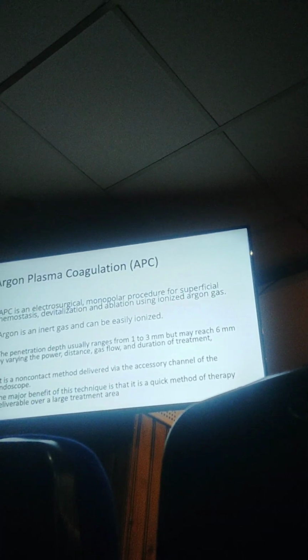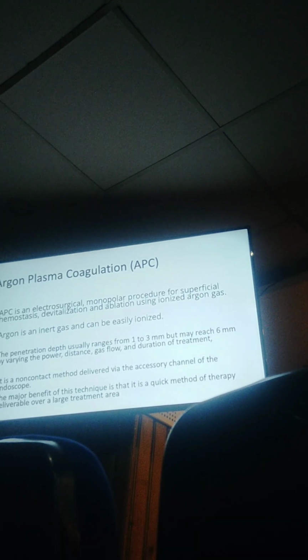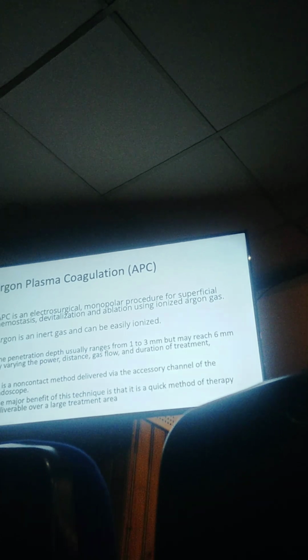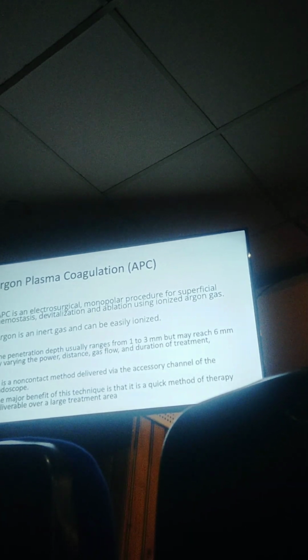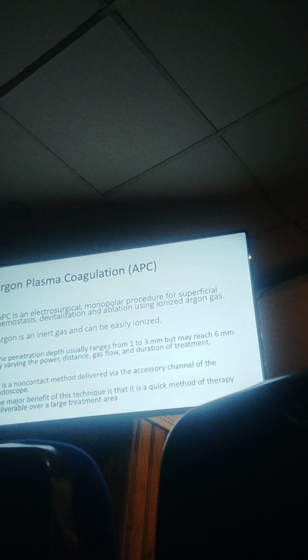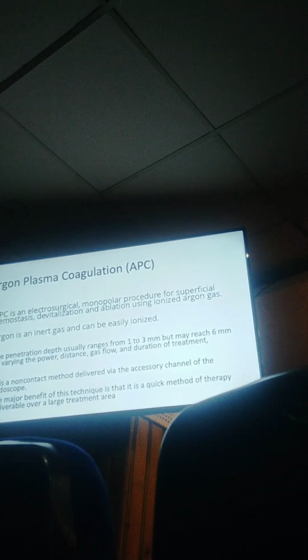Another device is argon plasma coagulation, APC. It is again an electrosurgical device, but a monopolar type basically. It is used to achieve superficial hemostasis.